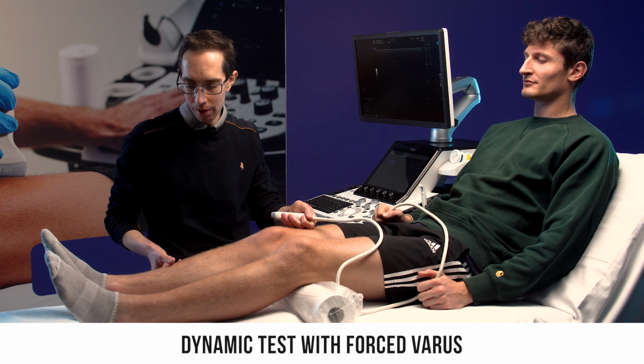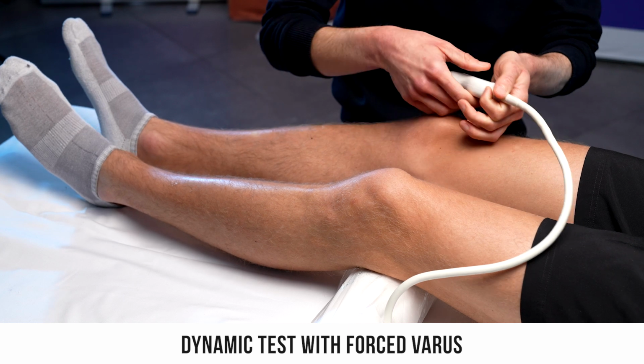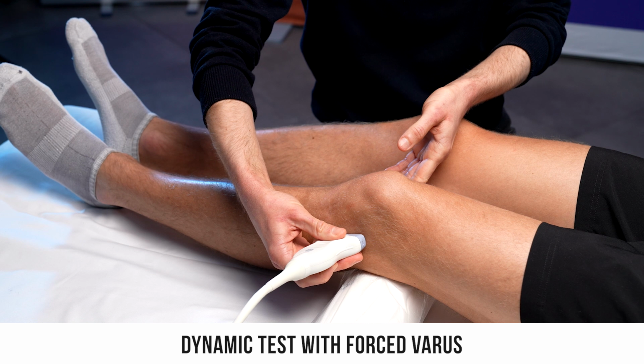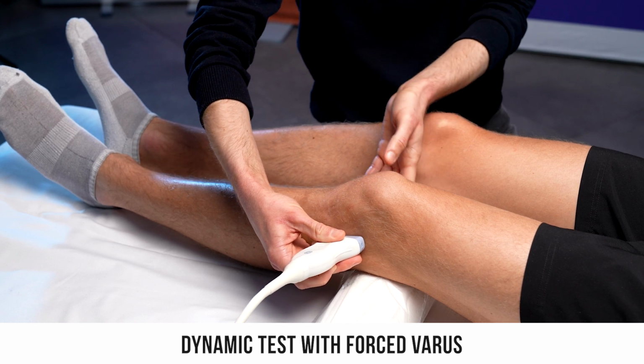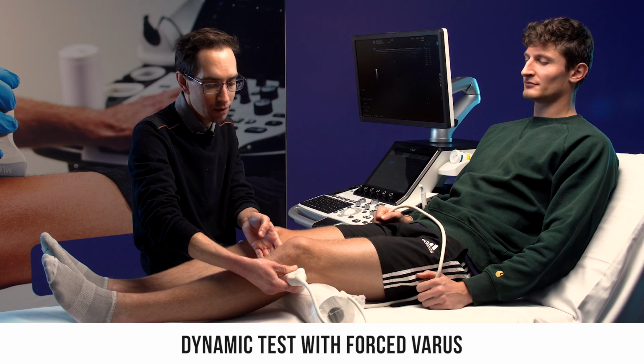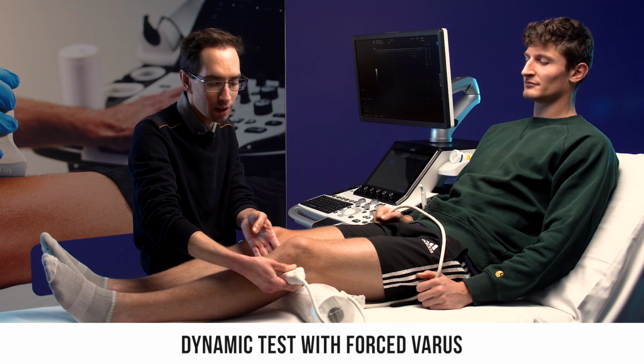To do this, we ask our subject to bring their feet together. Then we place the probe on the lateral side to watch the ligament while pressing on the medial side of the knee to check whether or not the tension on the ligament remains.